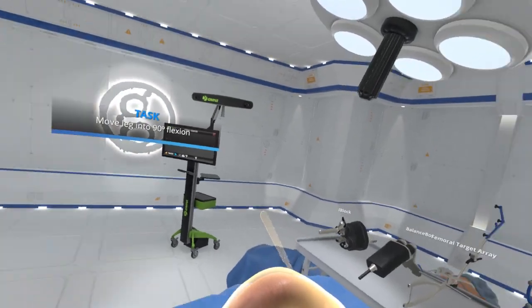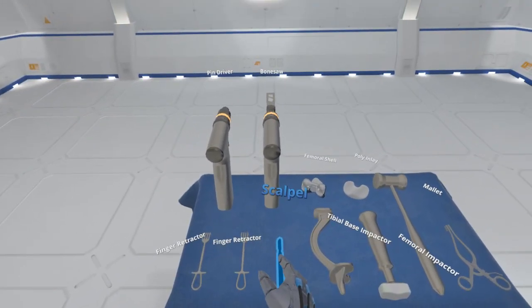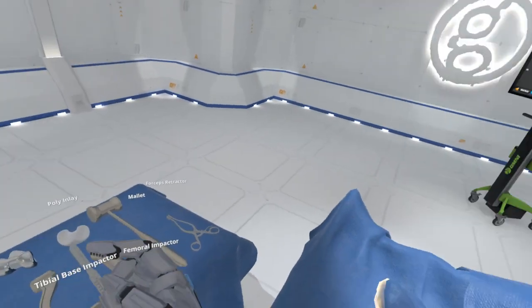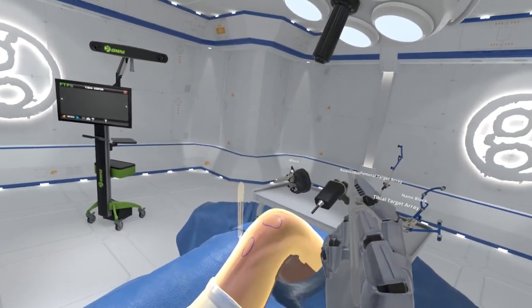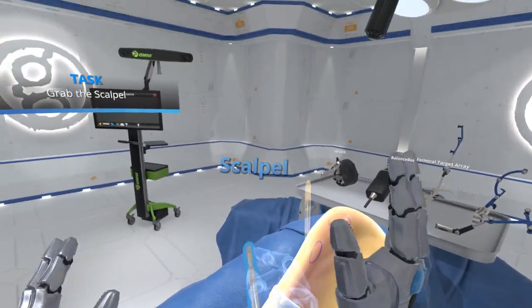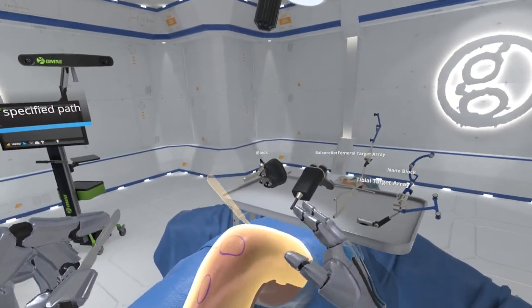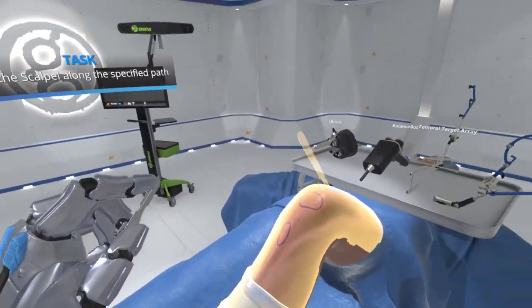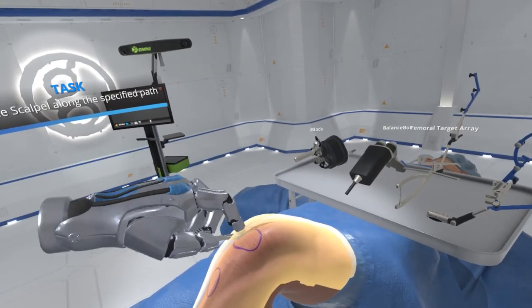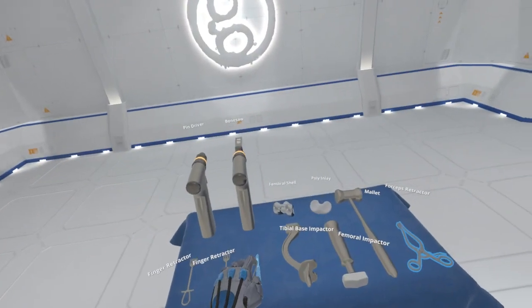Select the scalpel from the Mayo stand to your left. Good, you will see a linear highlight on the knee showing the optimal path for the skin incision. Select the scalpel from the Mayo stand to your left. Use the scalpel to make the incision. You may probe the margins of the incision with your finger.